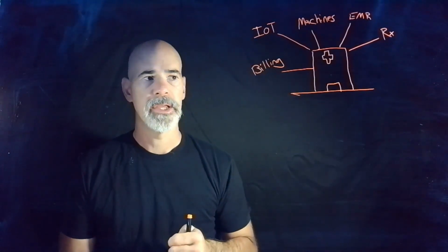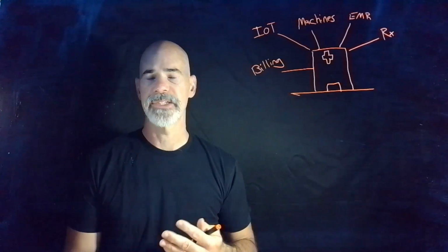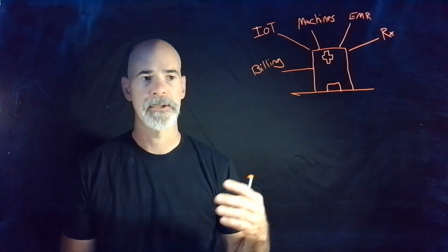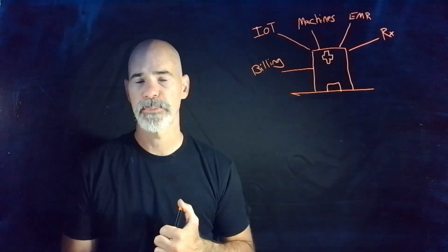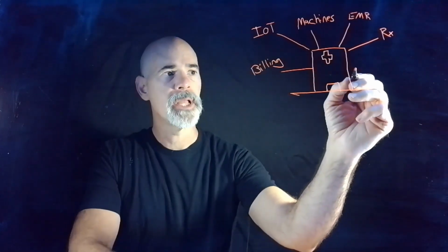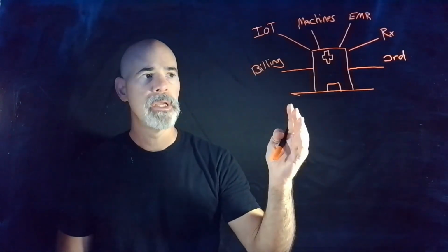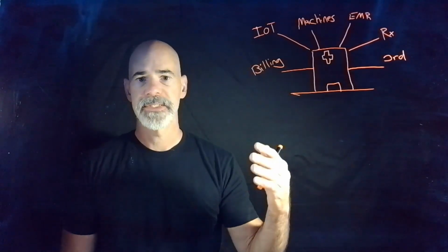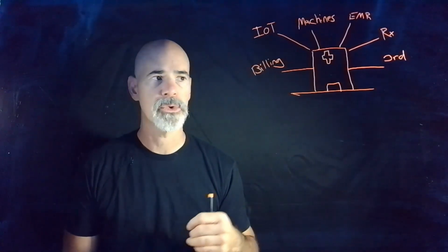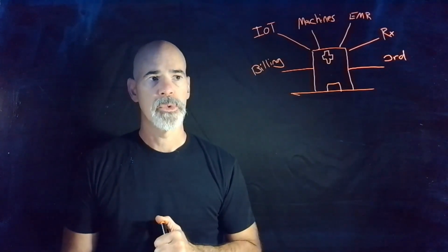You have a billing setup in order to bill either insurance companies or bill the patients that are coming in. And then, of course, you have IoT devices, these medical IoT devices, so insulin pumps, pacemakers. If you've ever had a sleep study done, maybe you get sent home with an at-home sleep study. And even the fitness trackers or the smartwatches that we wear collect a lot of information as well. One other thing I will point out is that you also have a lot of third-party tie-ins to other hospitals within the system, physicians. You're probably connected to services that store more data about the patient in the cloud or as a SaaS service. So there's a lot of third-party connections that the hospital will connect with.